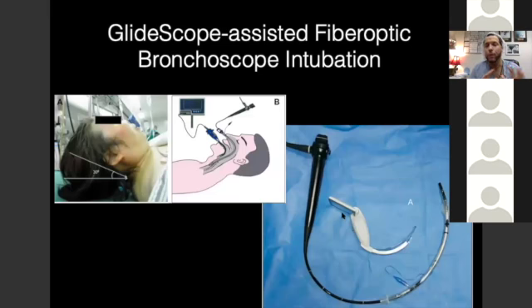And one point I really want to drive home today is this technique where you cheat. So you go to intubate and you can't see anything. You're ventilating okay. Everyone comes in the room, or let's say you're called in the room, right? You can really be the hero. You grab the fiber optic scope, put the endotracheal tube on it, and put the Glidescope in the mouth.